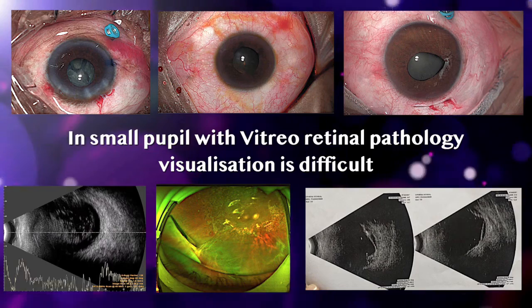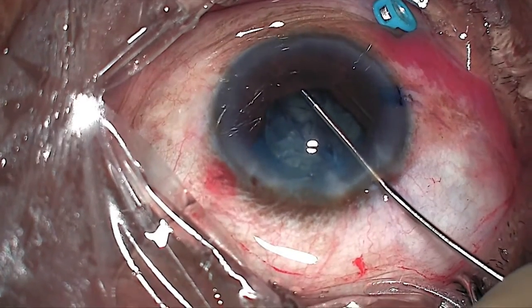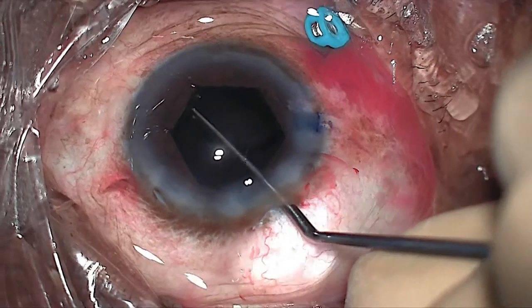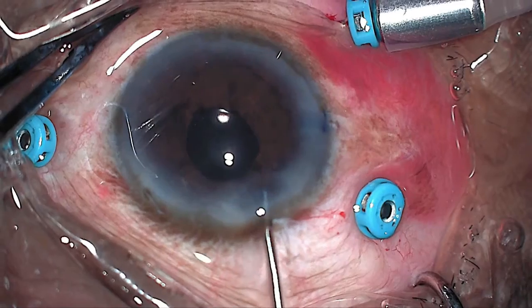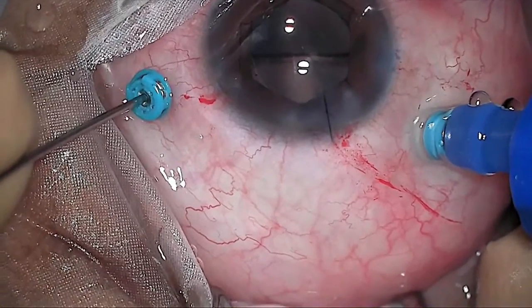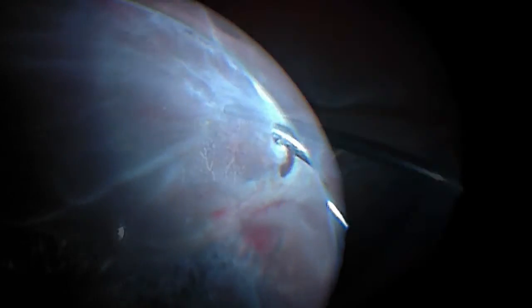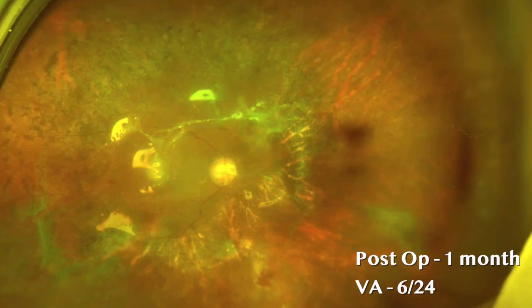The BHEX has been used in a series of vitreoretinal surgeries. The BHEX provided good visualization for cataract removal followed by vitrectomy for vitreous hemorrhage and laser photocoagulation. This is a silicone-filled eye with PVR where the BHEX provided good visualization for silicone oil removal followed by PVR membrane removal, identification of the break in the extreme periphery, retinotomy, and fluid-air exchange — with gratifying results.